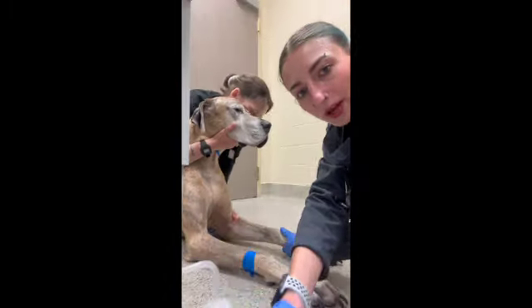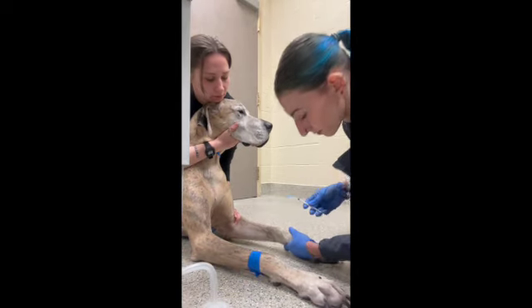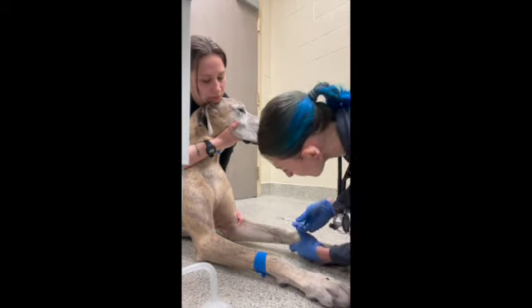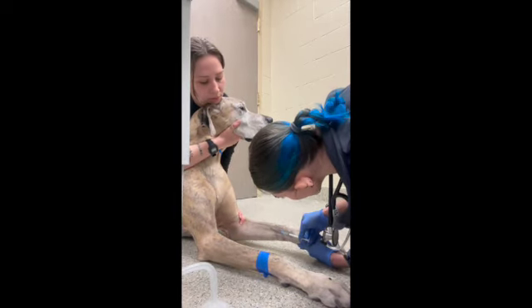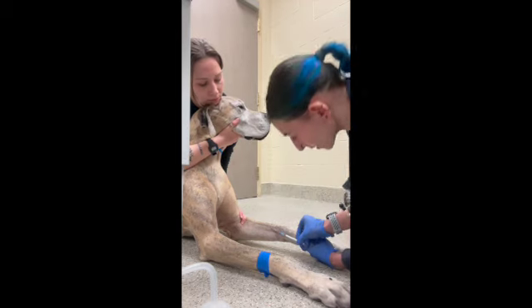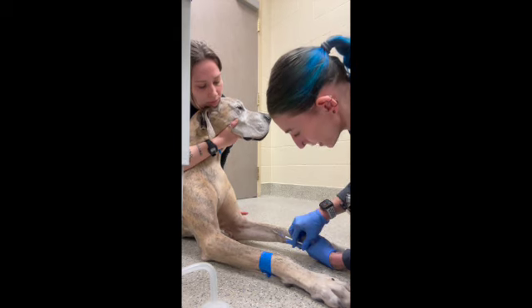Alrighty, we're going to give an intravenous injection for our canine patient. You're going to draw back to make sure that there is blood in your syringe, and then once you see blood, you can go ahead and push the medication.